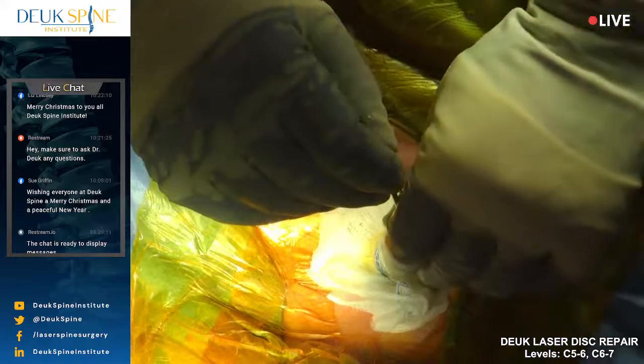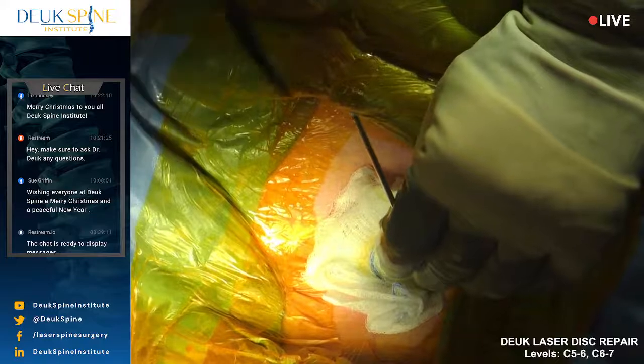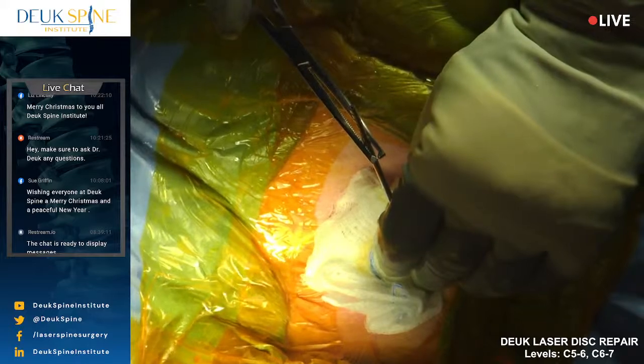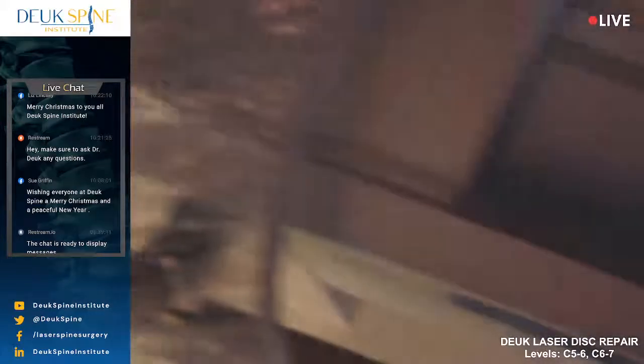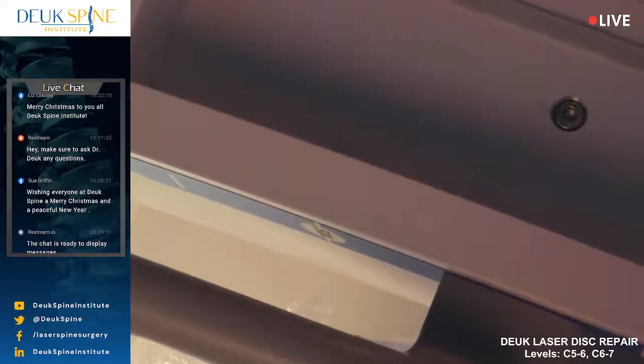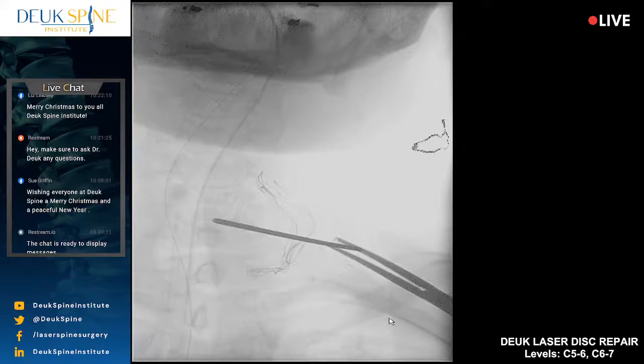How you doing, Luis? I'm good. AP. So I'm using a side view and a front view of the spine. Just a quick shot. And I'm going to march this dilator up the spine. So I'm a little bit on my side, so I want to cheat a little bit to the middle. Relax. Just stay there. Shot. That's perfect. Let's go back to a lateral view.